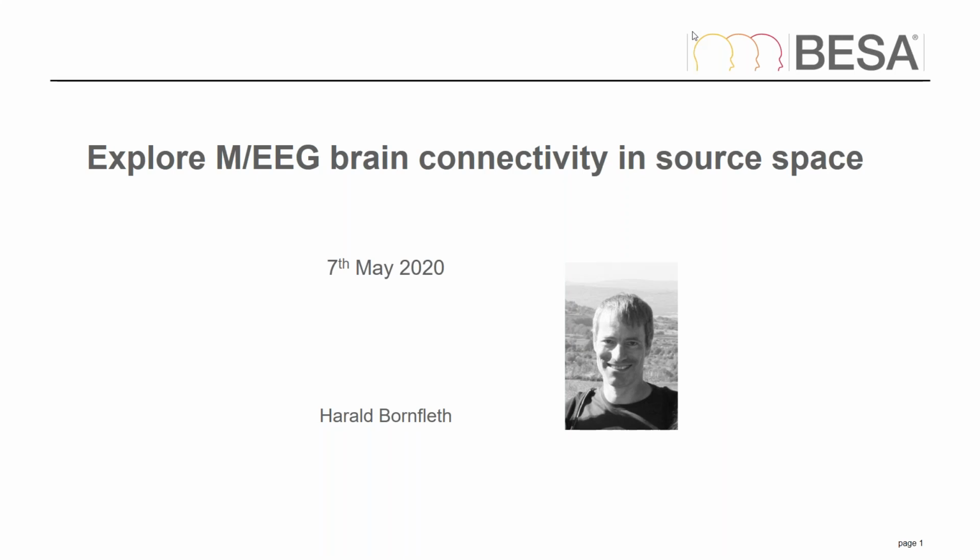So today I'm going to speak about exploring MEG and EEG brain connectivity in source space.